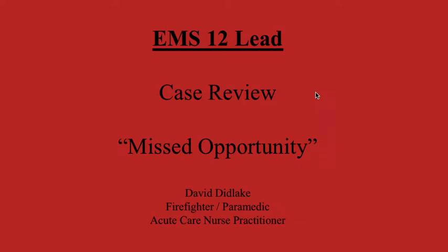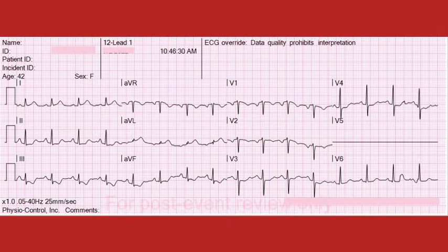This is David Didlake with EMS 12 Lead, and I'm going to present a case review regarding a missed opportunity for early cath lab activation. So let's just jump right into this.